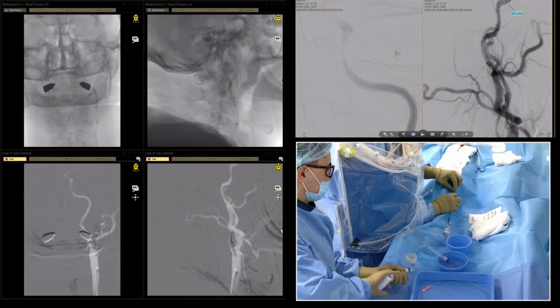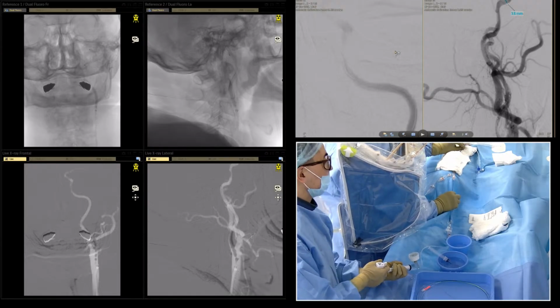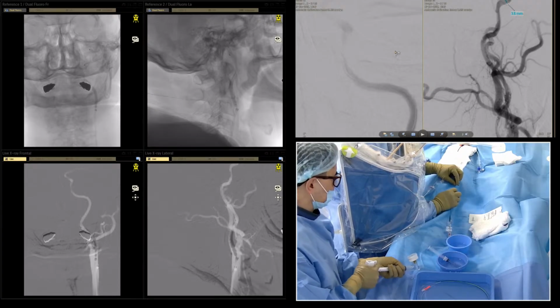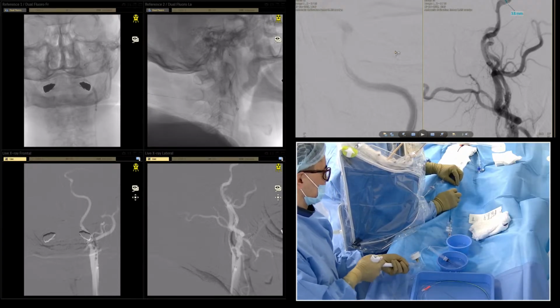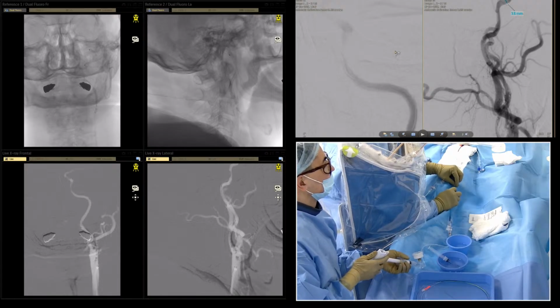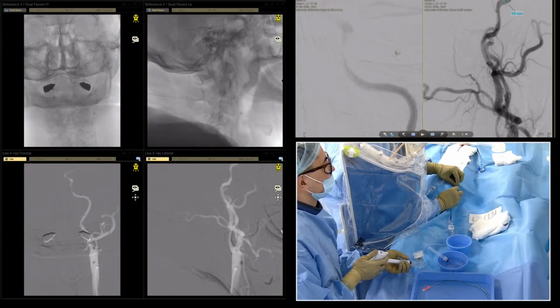I'll give 16 atmospheres. Second. Yes, the only problem is it's an open cell design, and sometimes it's problematic to push.